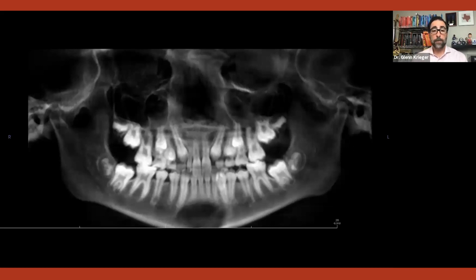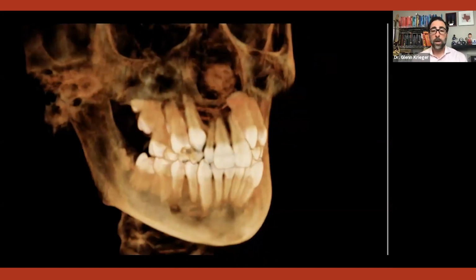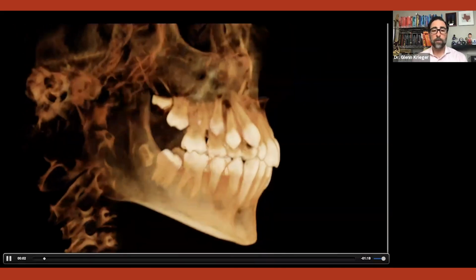The upper second bicuspid seem to be coming in a reasonable direction, and all the lower teeth seem to be coming in a pretty good spot. So now take this case and look at her, look at those two particular areas, right? Where is that cuspid coming in on the left against the central? And how long is my root really on my lateral incisor? And where is that cuspid erupting? Well, let's take a look at it and see what we've really got.